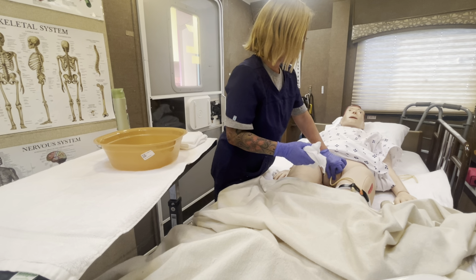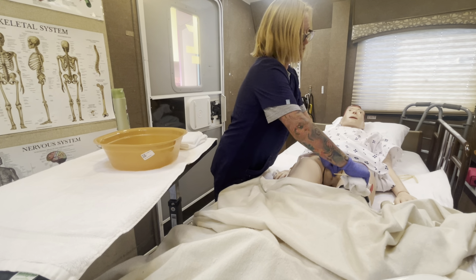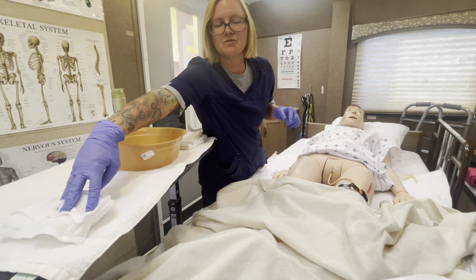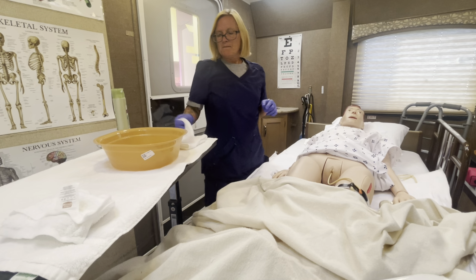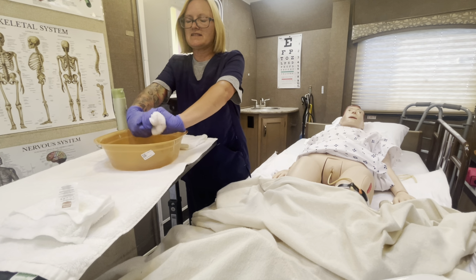Remember, this has soap on it, so I'm washing. Pinch at the meatus on the catheter, go 4 inches down. This is dirty, so this is why I have a barrier here, so I'm going to place it on my barrier. My next towel, I'm going to put in and get water on it, and this is for rinsing.